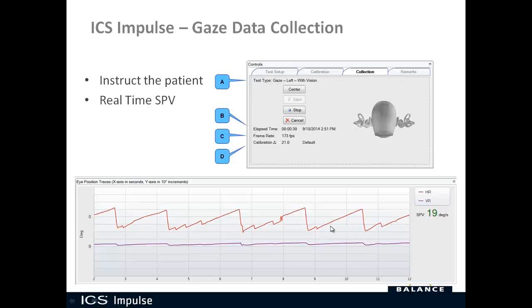On the data collection screen, the red trace is horizontal and the purple is vertical, and you'll see the real-time SPV — slow phase velocity. That SPV number is displayed in green or orange: green means it's reliable, orange means it may not be quite reliable and is jumping around a lot. If the person is truly staring in one direction as instructed, the SPV number will stay consistent and be green.